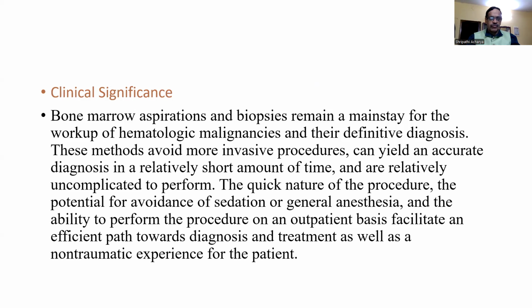Clinical significance of bone marrow aspiration. Bone marrow aspirations and biopsies remain a mainstay for the workup of hematologic malignancies and their definitive diagnosis. These methods avoid more invasive procedures, can yield an accurate diagnosis in a relatively short amount of time, and are relatively uncomplicated to perform.